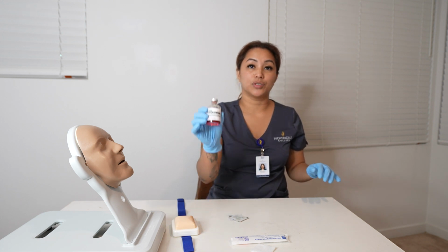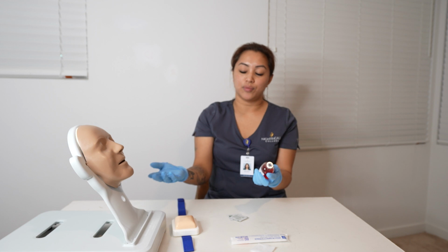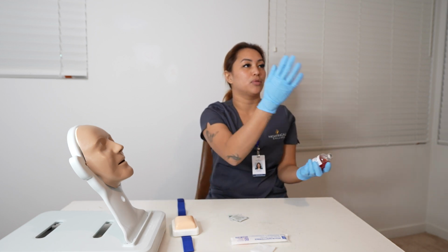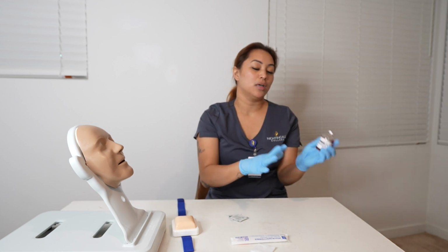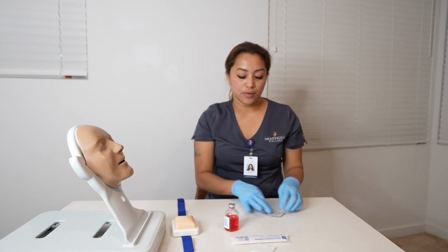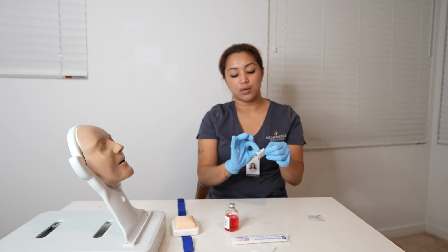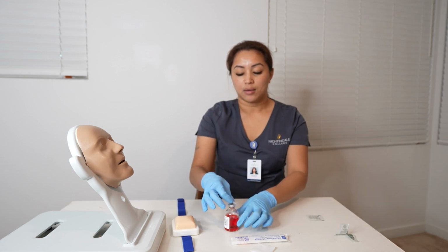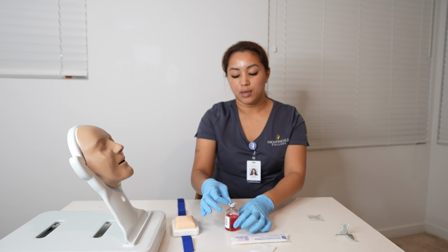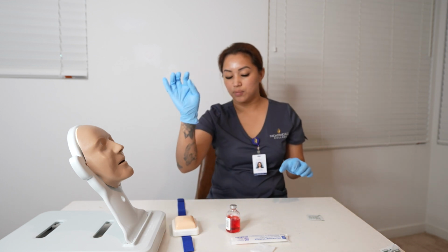Now I'm going to check the medication vial, make sure that it is for Miss Smith and it is heparin, and I'm going to check the MAR, EHR, second verification. Alright, perfect. So now that we have verified that, I'm going to clean the medication vial with an alcohol swab, inner to out. Alrighty, put that in the trash bin.